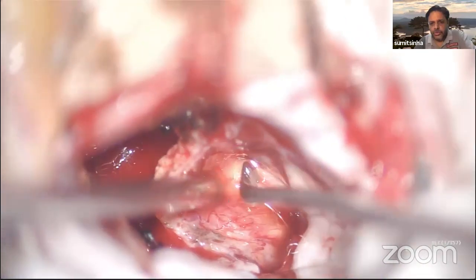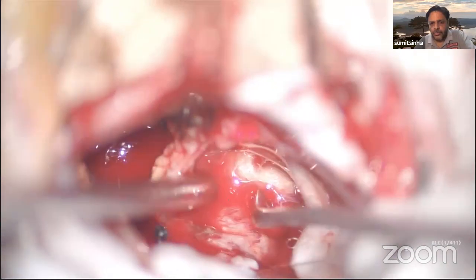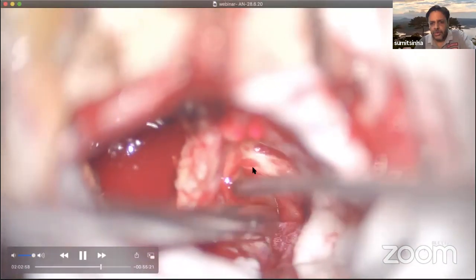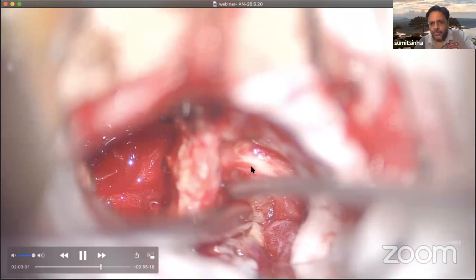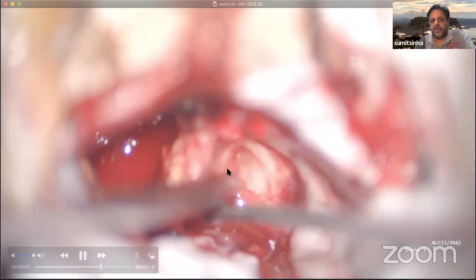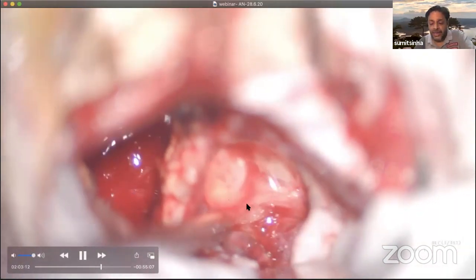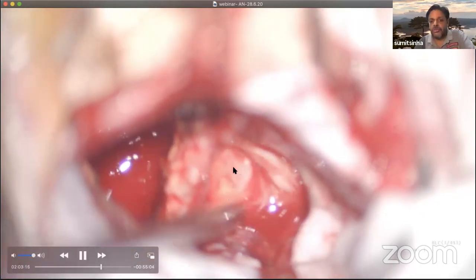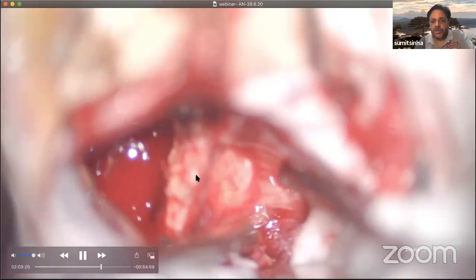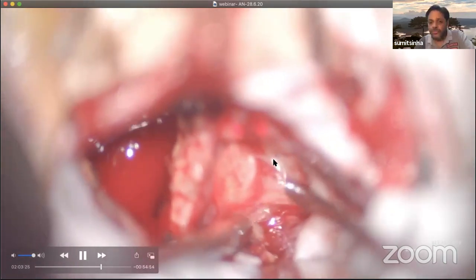Okay, so this is the lower pole of the tumor, and that's the facial nerve. That's the facial nerve. You see that? That's the facial nerve. So the crux is that the tumor is separated away from the facial nerve, and it's not like otherwise. I mean, if I again repeat, the tumor has to be separated away from the facial nerve. Catch hold of the tumor, and you separate the tumor away from the facial nerve without stretching the nerve. And this is the crux. It has not to be the other way around.